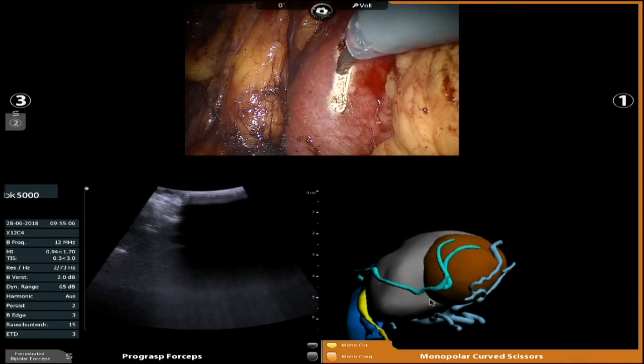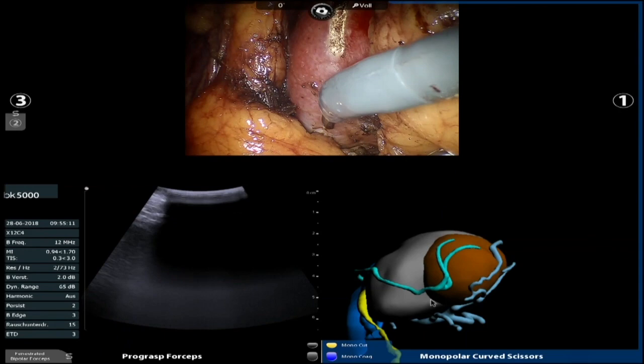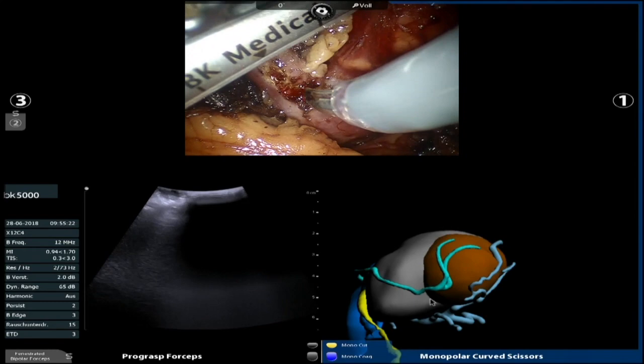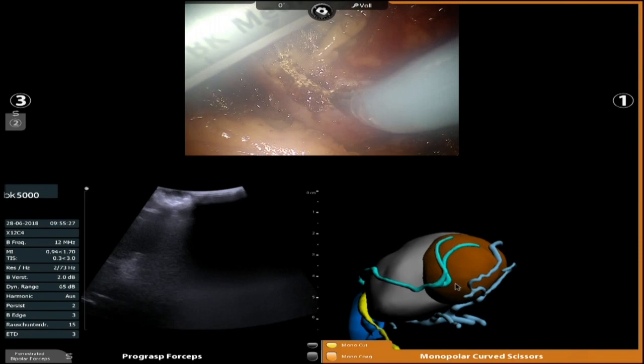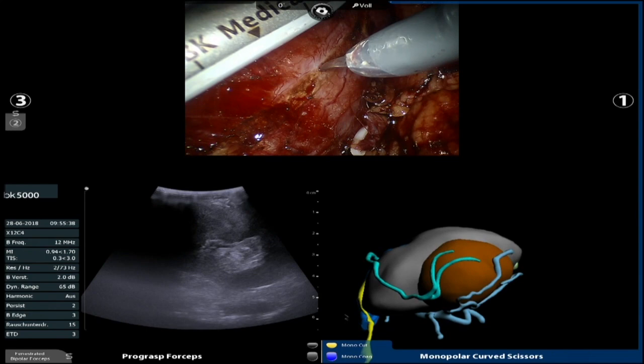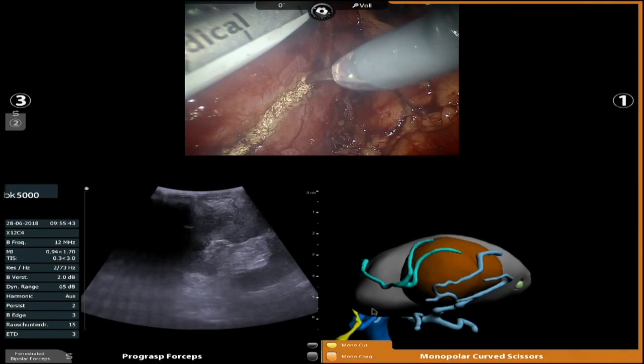According to the incision you mark now, it probably will be a wedge resection more than enucleation. No. A few millimeters. No. You think it will go? Yeah. So you don't want to start your incision right on the tumor. So this will be an enucleation, but I'm taking a little bit of the cortical tissue on top, but I will find the tumor very quickly. So you go down to the tumor and then you follow the tumor. Exactly. But you don't want to start right on the tumor at the cortex, in my experience. You want to find the tumor and then go on it. I'm giving myself a little border here to make sure that I'm not going to start right on the tumor. But I'm going to find the tumor very quickly. That's my goal.